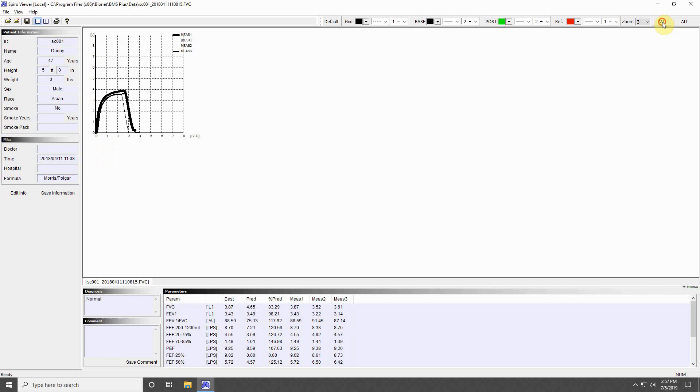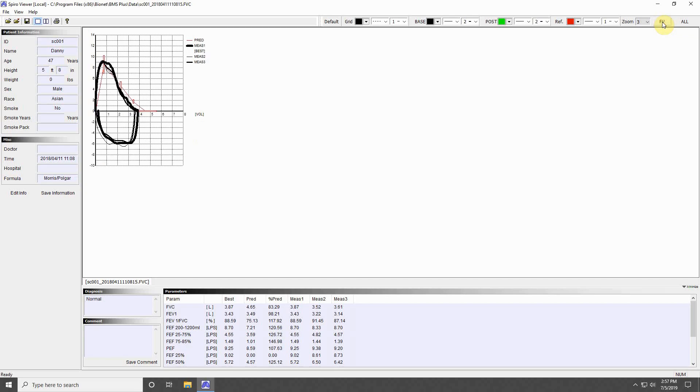Press here to toggle between Flow Volume and Volume Time displays. The last button will display all measurements in a test or simply the best one.